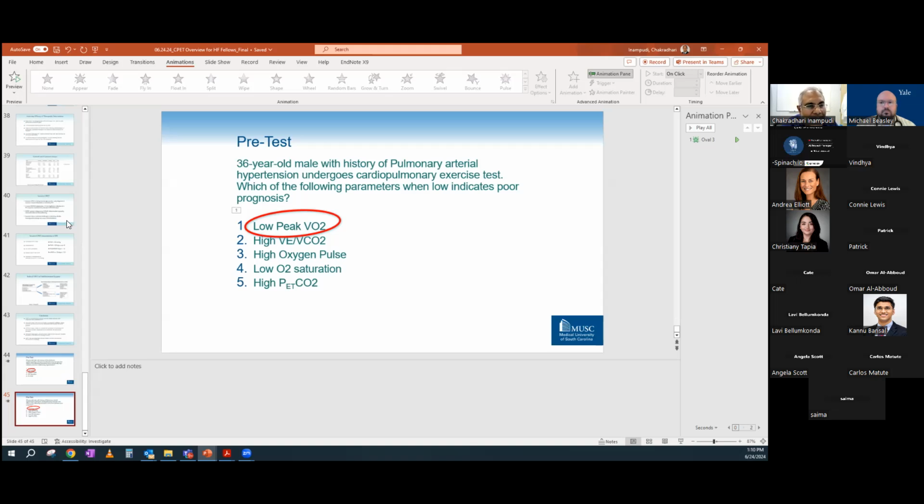Less likely this is a patient that I would want to continue to be seen in the pre-transplant clinic. But if they drop from 14.7 to 12.5, this is somebody who I probably would want to make sure that we're continuing from an evaluation standpoint. So that's one of the common things.